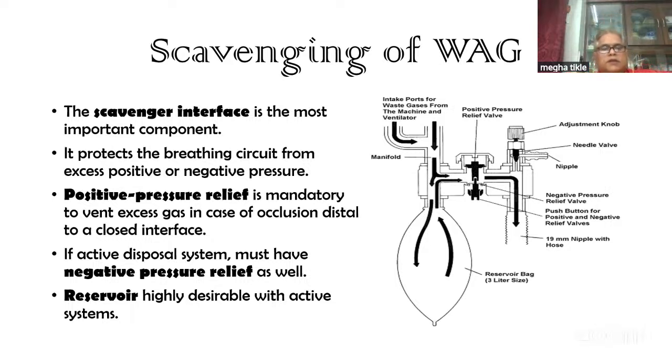Now, reservoirs are highly desirable with an active system because they can maintain certain pressure in the breathing system, and there will not be any damage or hypoxic gas going to the patient or unnecessary triggering of the ventilator.